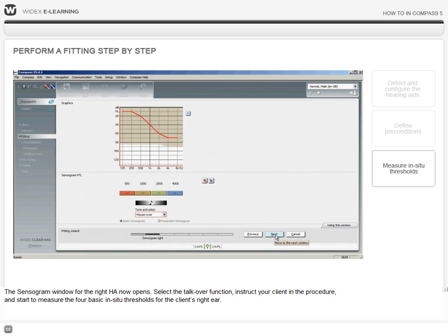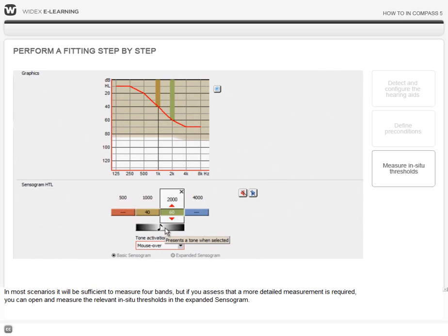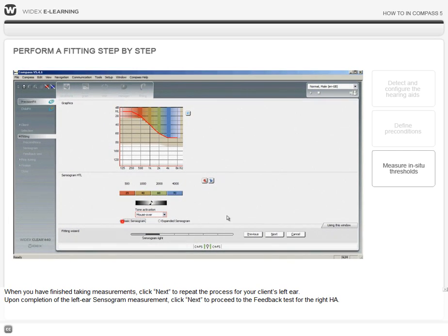The Sensogram window for the right hearing aid now opens. Select the talk-over function, instruct your client in the procedure, and start to measure the four basic in-situ thresholds for the client's right ear. In most scenarios it will be sufficient to measure four bands, but if you assess that a more detailed measurement is required, you can open and measure the relevant in-situ thresholds in the expanded Sensogram. When you have finished taking measurements, click Next to repeat the process for your client's left ear.